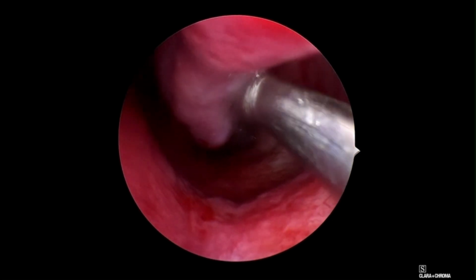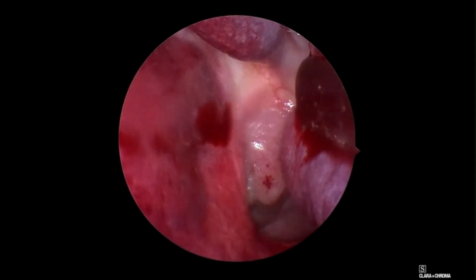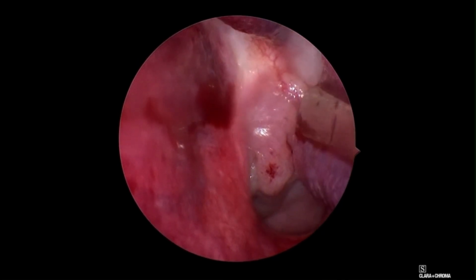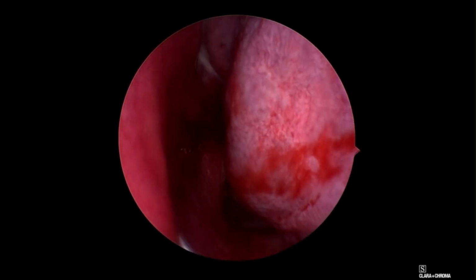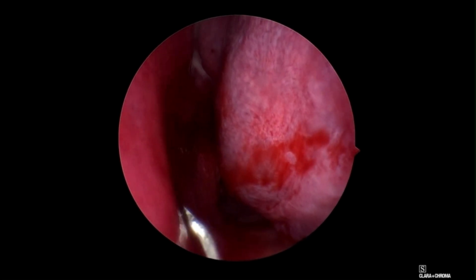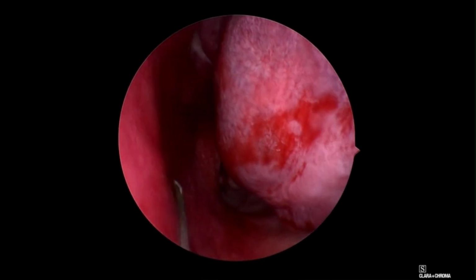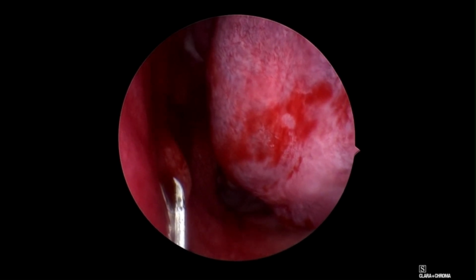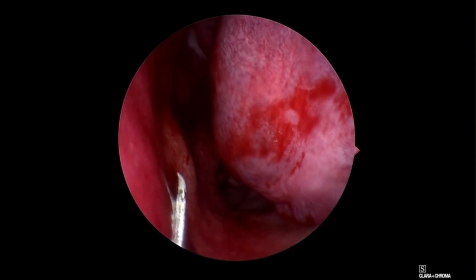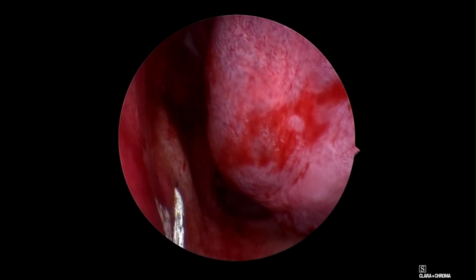Outfracturing of the inferior turbinate, so as to increase the space, which is very important in this kind of surgery. Local infiltration was given along the septum. In this case, I have made use of a septal crossover technique. Sufficient infiltration was given along the septum.